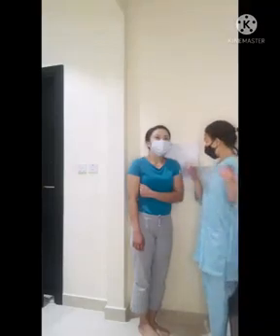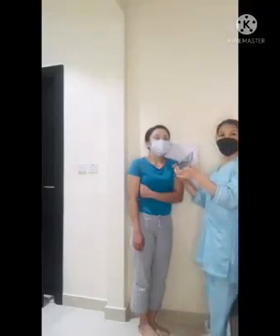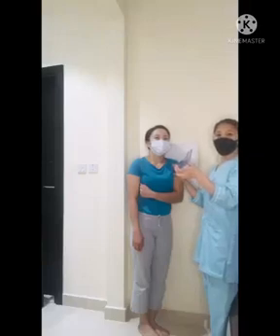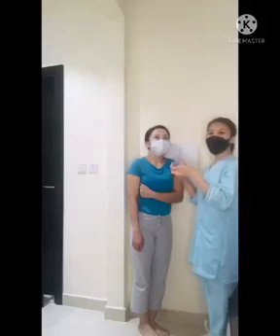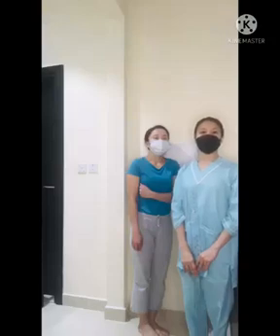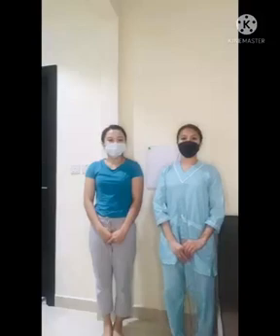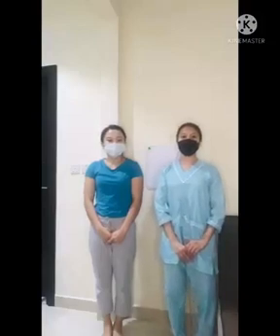So, the central ray in this projection is 45 degrees caudal to the scapulohumeral joint. So, the structure shown in this projection is Hill-Sachs lesion, scapulohumeral joint, coracoid process. The fifth projection that we're going to do is the clavicle AP axial lordotic method.